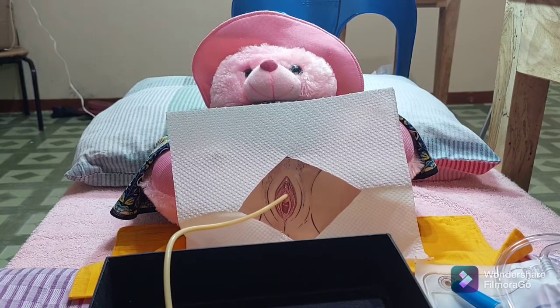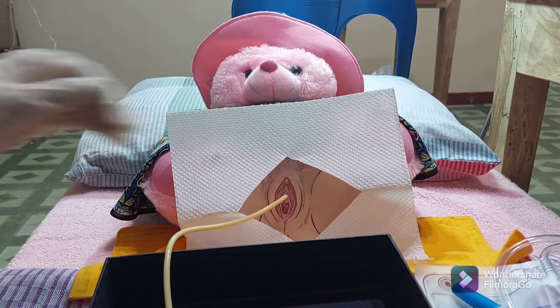Connect the urinary bag to the catheter using sterile technique. Keep the urinary bag below the patient's bladder.